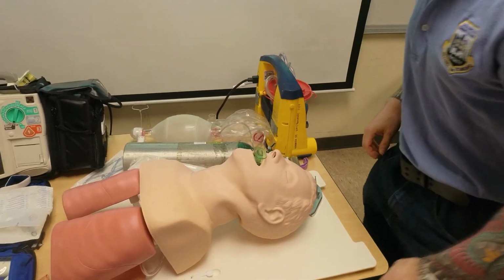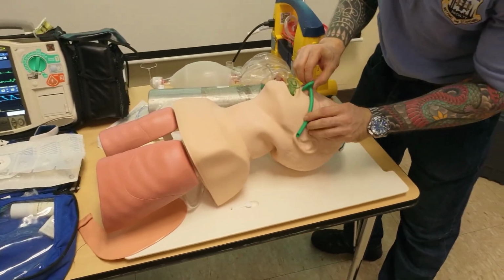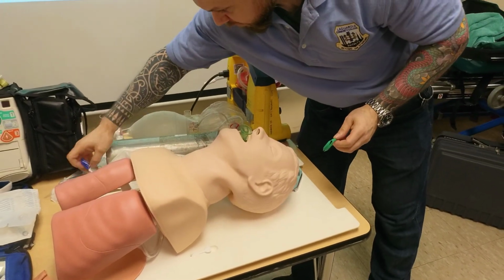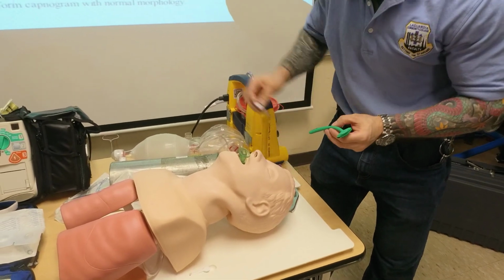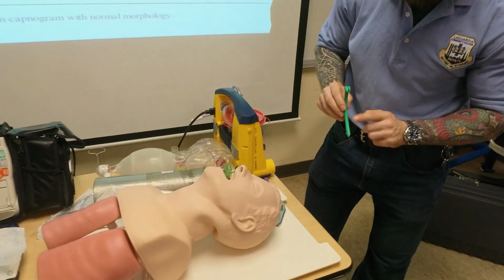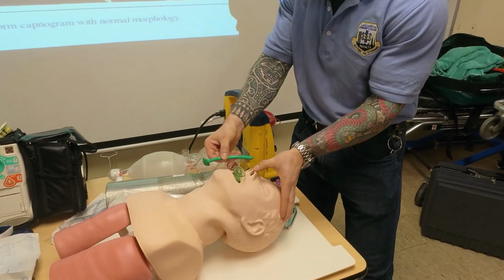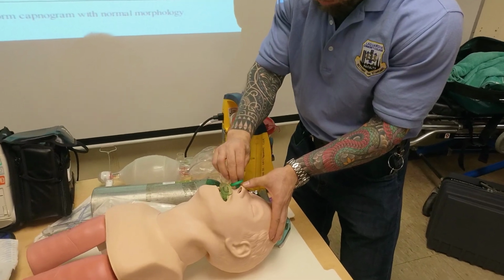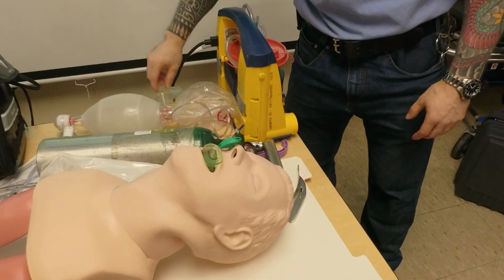The next thing I'm going to measure is my nasal trumpet. We said from what? From the nose to the... For these, you want a little bit of lubricant. You don't need a lot, just a little bit, so it facilitates entry. How you insert it: provide slight traction on the nostril. Don't push it back towards the head. You're going to put it straight down, at a 90-degree angle.